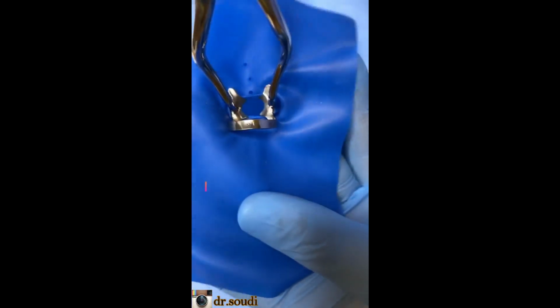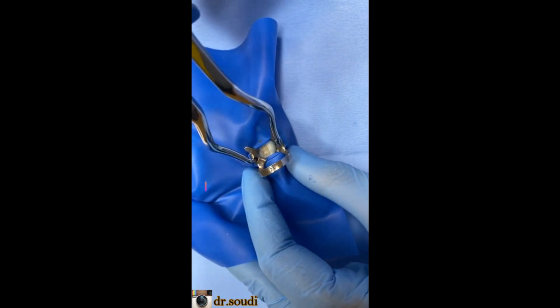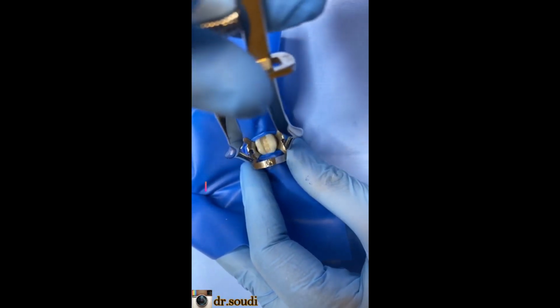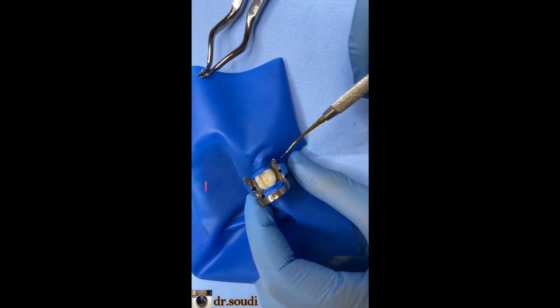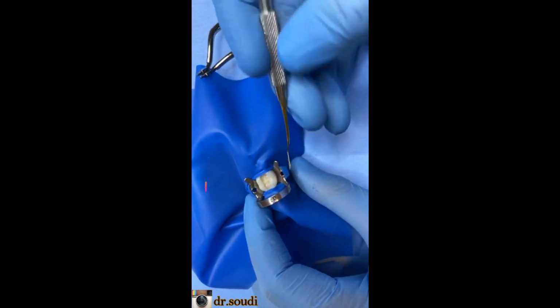How will I apply it? Like the same I did, like this. I will open the clamp. I need to see the tooth. Before I open the clamp, open the clamp and apply your clamp to the tooth like this slowly. Take care of the gingiva like this. After this I push the sheet over the clamp with a composite spatula like this.